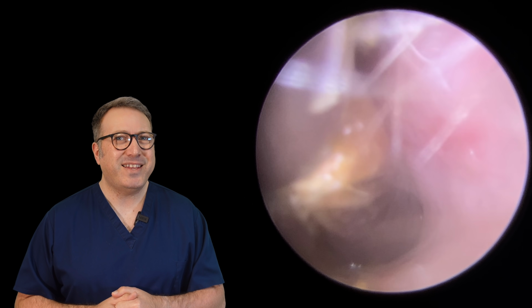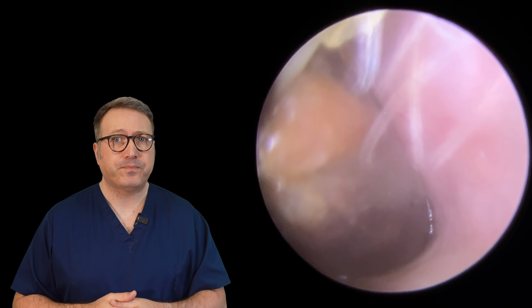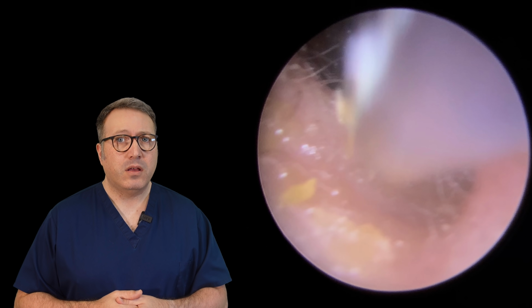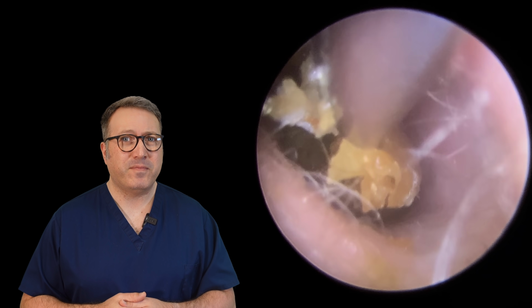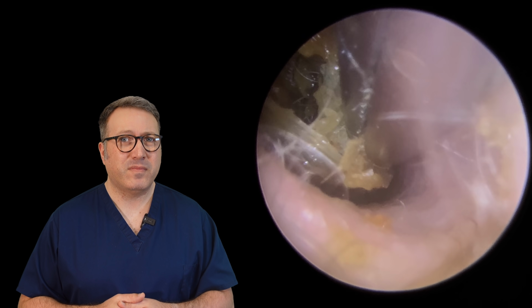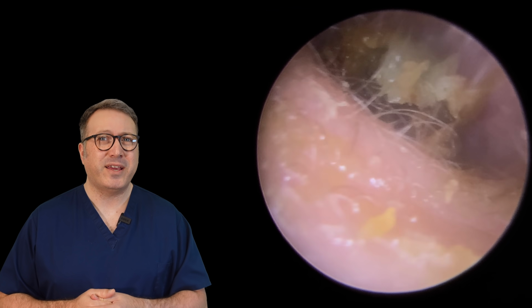There we are. You can see we're trying to draw this down the canal here. Let's grab it with the crocodile forceps again there. Just sheared it away again.